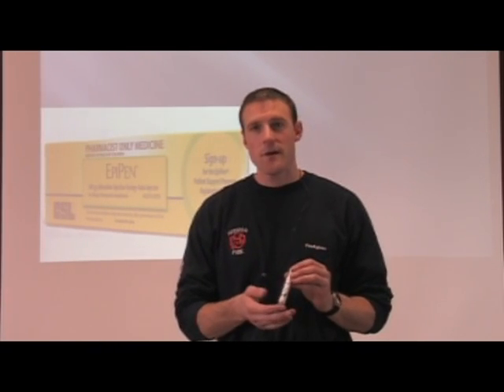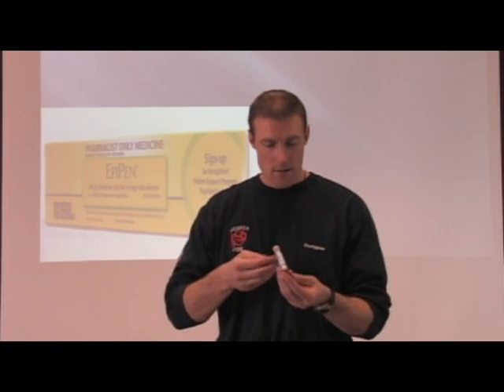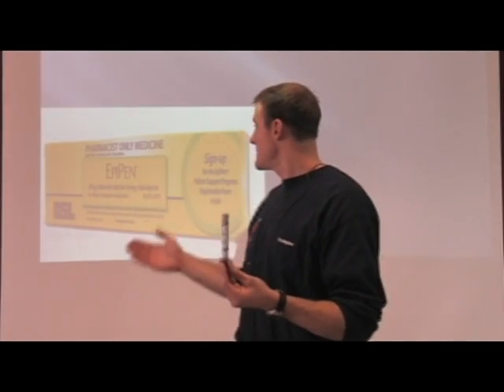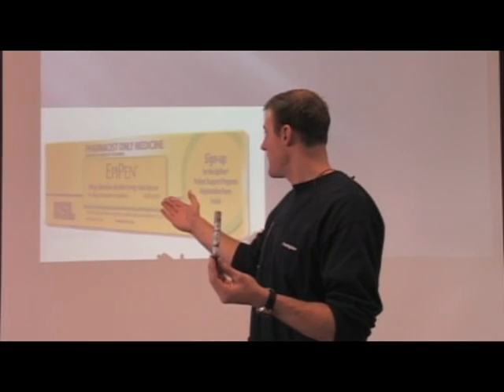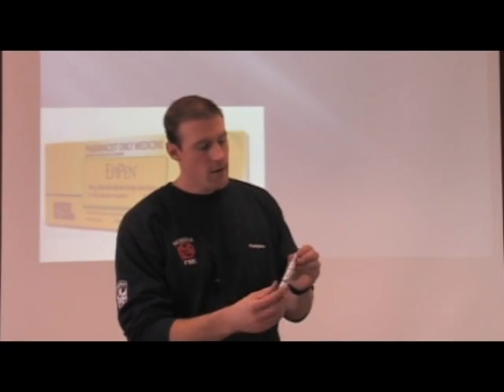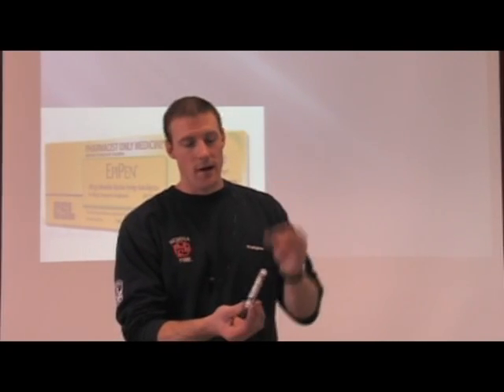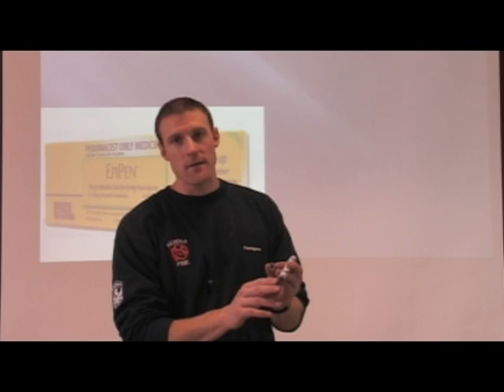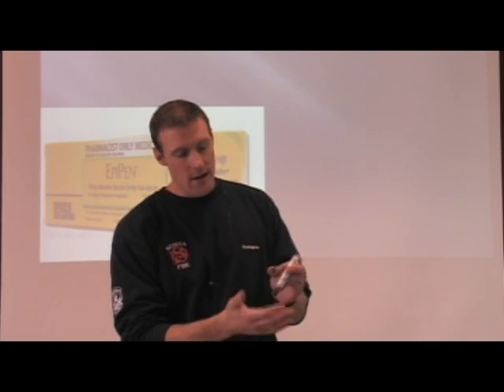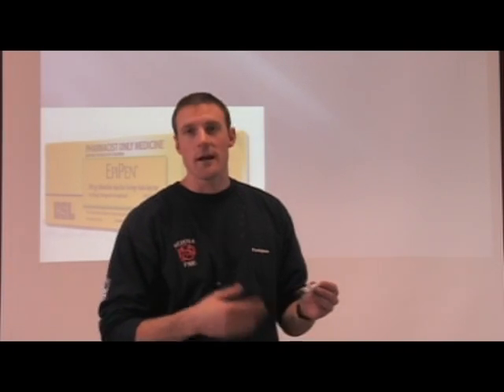It's very simple to use. The instructions are right on the pen, and a lot of times they'll come in boxes like this, with instructions inside on the box or on the pen. The first step is to remove the cap from the top. This is where the needle is, and it stays inside so there's no chance of it poking you with the cap on. Once you remove the cap, be more careful — make sure you don't hit yourself or someone you're not intending to.